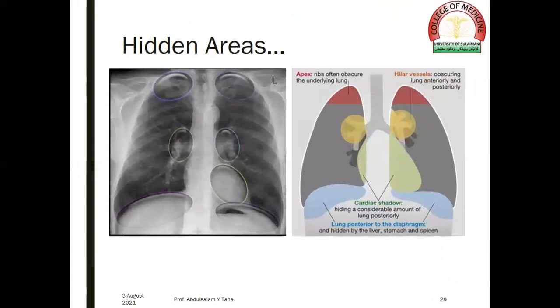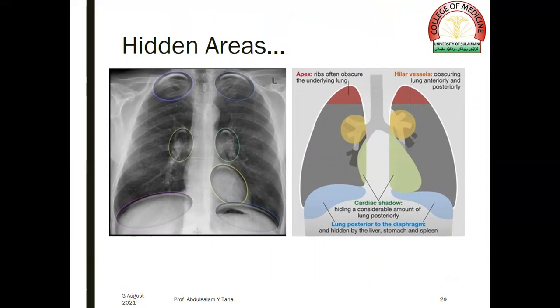The hidden areas we should be careful about include the apex — ribs often obscure the underlying lung in that region — the hilar regions, because the hilar vessels obscure the lung anteriorly and posteriorly, the cardiac shadow, which may hide a considerable amount of the lung posteriorly, and the lung posterior to the diaphragm, which is hidden by the liver, stomach, and spleen.